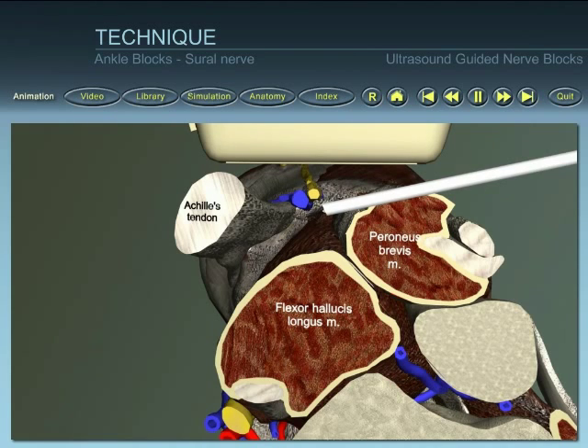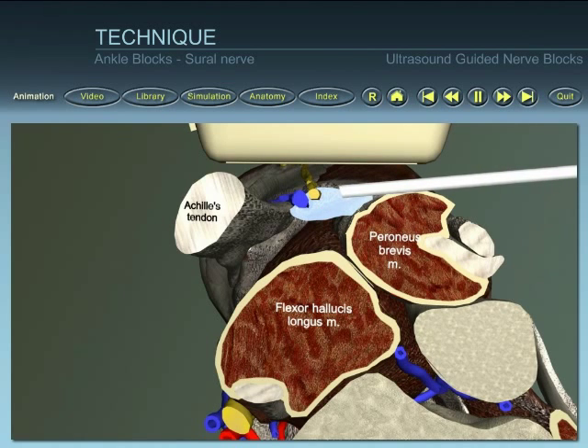Visualize the initial spread of local anesthetic around the nerve. Inject a further 4 to 6 mils of local anesthetic, observing the spread. Reposition the needle if the spread is not around or close to the nerve.